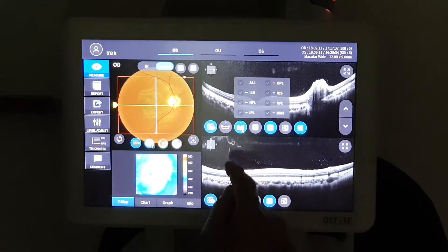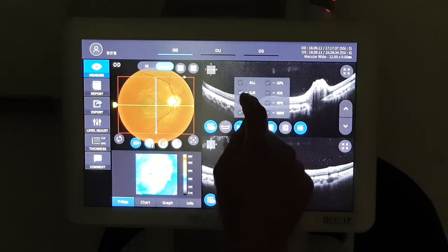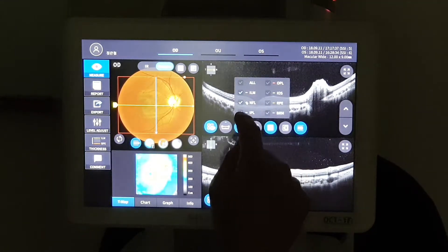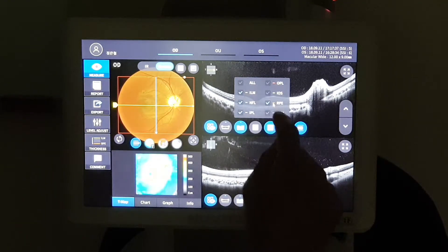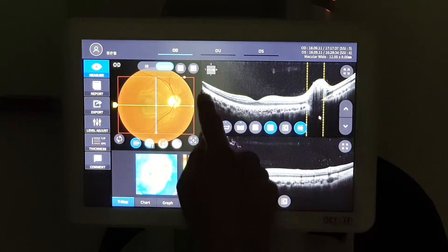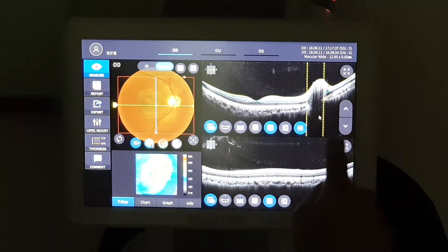In this analysis screen, we can choose the data with different color what you want to see.